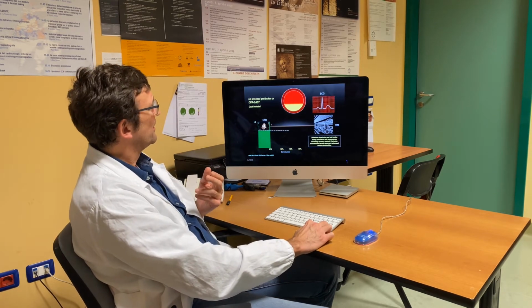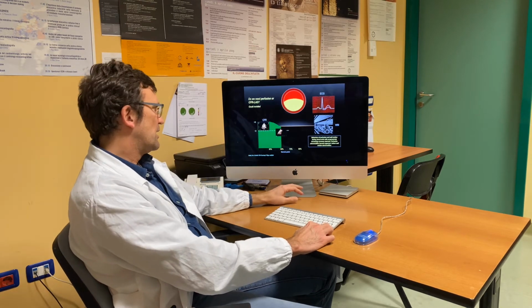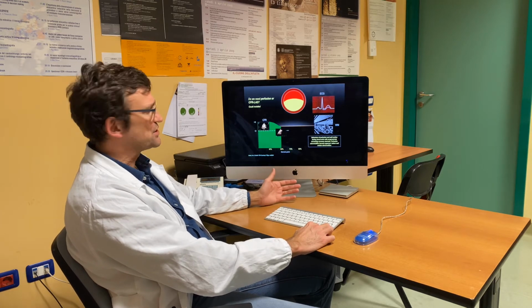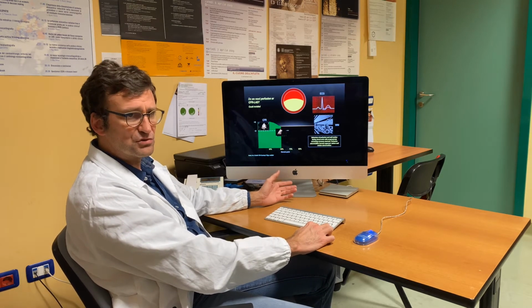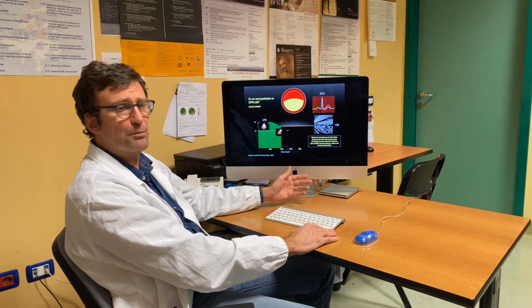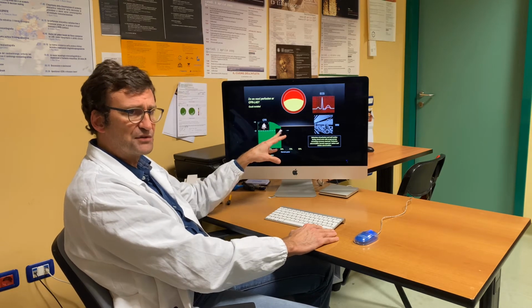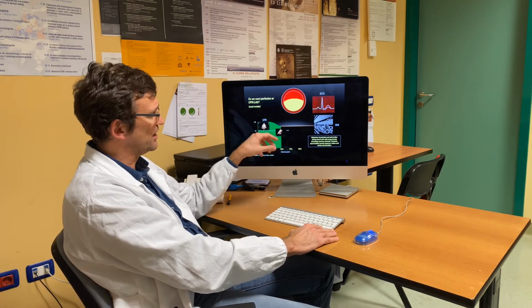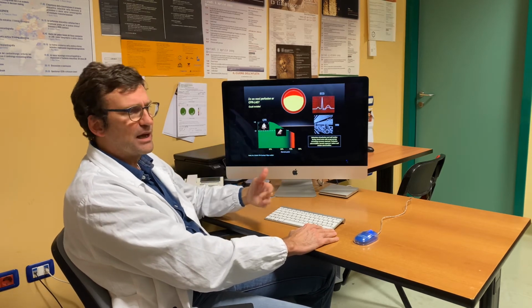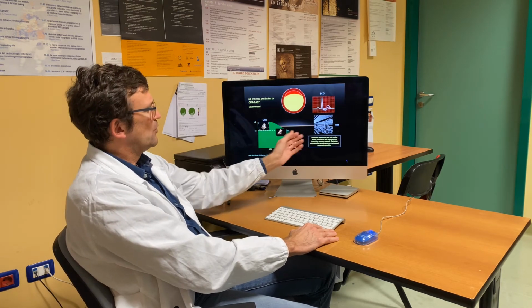As the coronary stenosis gets worse, when you're around 50%, you can probably spot some perfusion defects, and the CFR is borderline or slightly reduced, to 1.9 or something like that, where you can find also non-ischemic disease. You can find microvascular disease also in that spot. When the coronary artery plaque goes far beyond this, you will have wall motion defects.